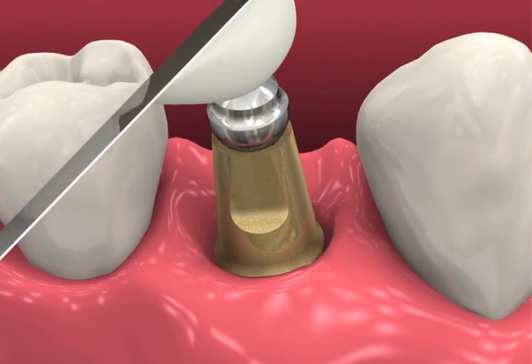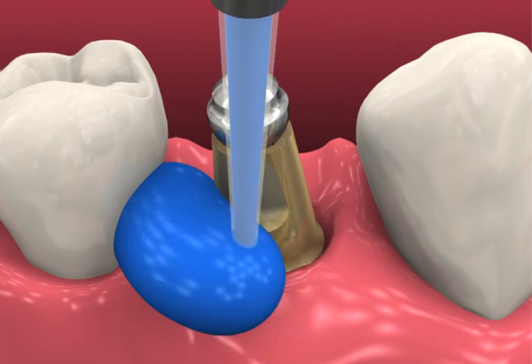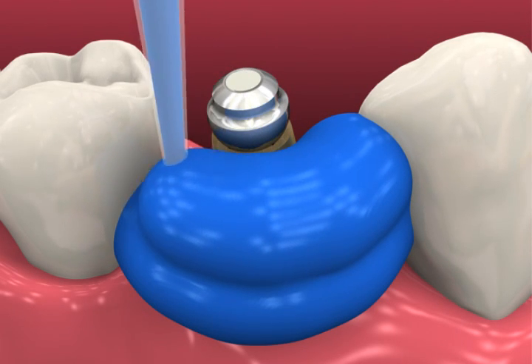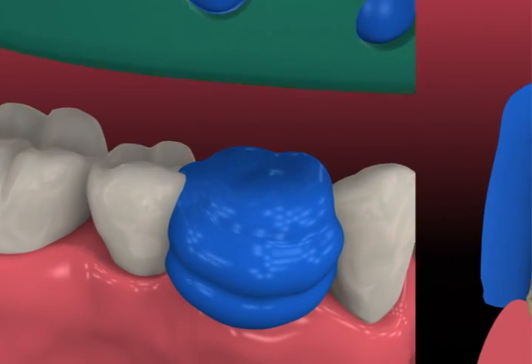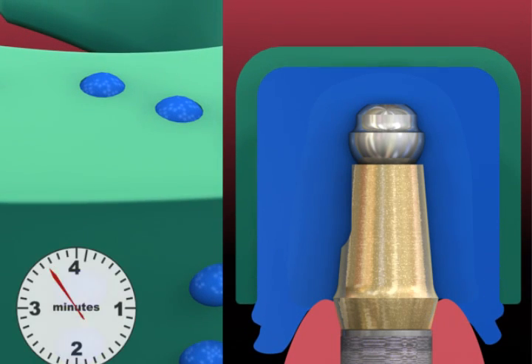Insert the ball top screw and finger tighten by hand or with the 050 hex driver. Radiographically verify complete abutment seating before making the impression. Syringe elastomeric impression material around the abutment ball top assembly.